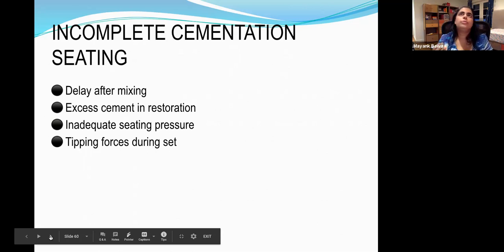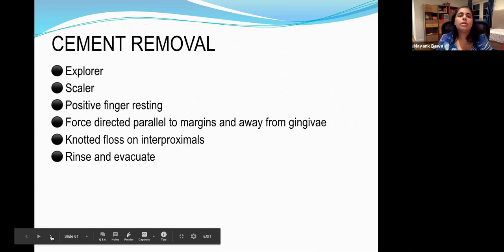If it's not in the right spot, you have to make sure where exactly it's going to touch, and where your margins are going to touch. You have to look for a landmark. It's really important for me to make sure that the crown is seating right, especially where there are two adjacent crowns. You have to be more careful in those kinds of situations.